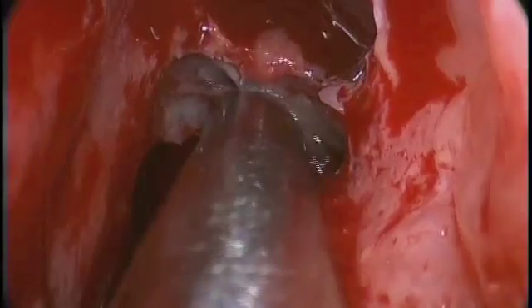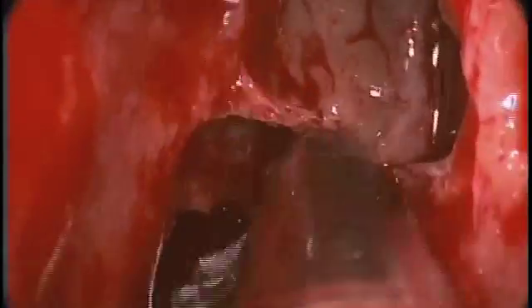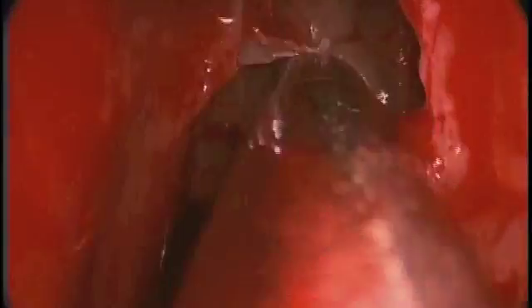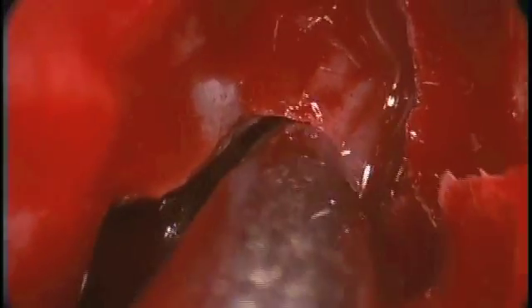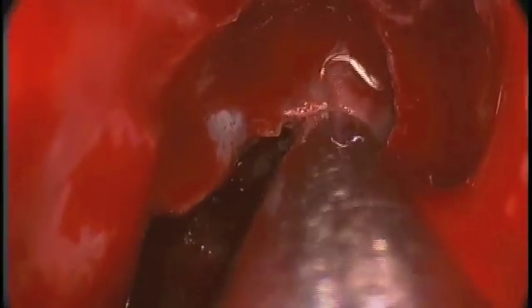Of course we are careful about this as we are approaching the patient's skull base, and we do not want to violate this region at all, which would cause a cerebrospinal fluid leak. The localization system is used multiple times during this, though not shown in this video — it appears to be just a suction, but we would be viewing the CT scan to make sure that we are indeed in a safe location.